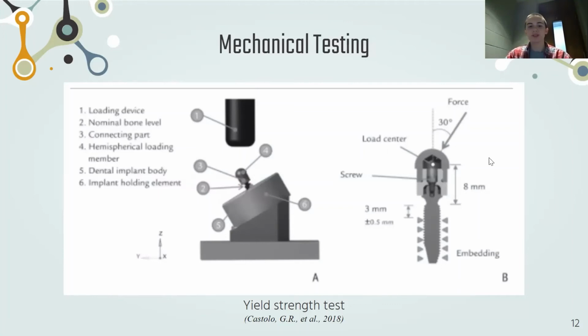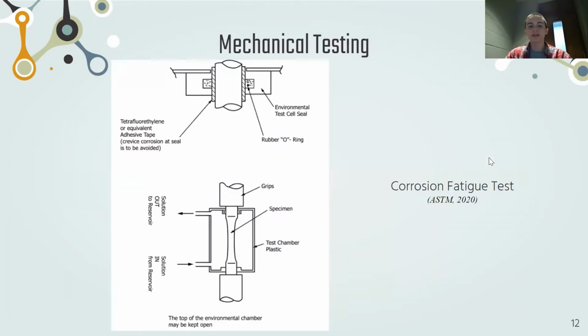The potential setup is shown for the dental implant using a testing chamber that simulates a corrosive environment inside the human body using a saline solution. Then the implant is tested for fatigue strength using an axially loaded test rig, which is what you see in the diagram. This would determine that Inconel 718 can be safely used in the human body without the risk of corrosion.